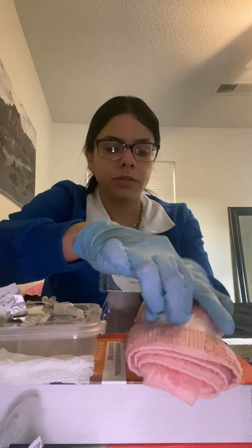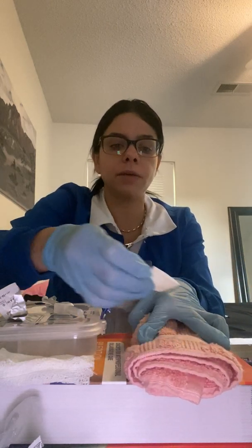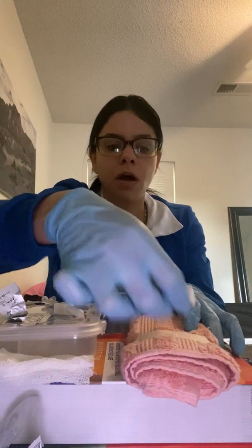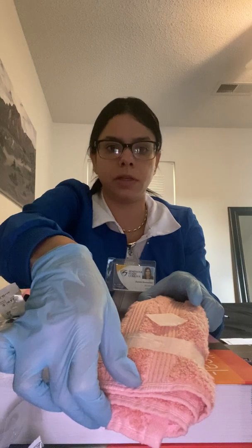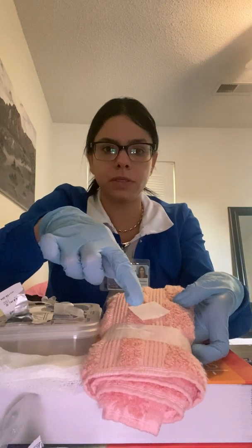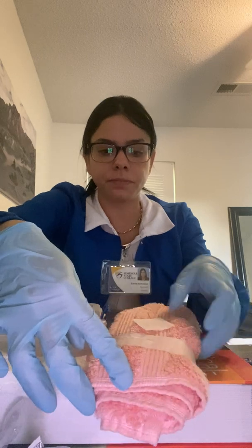All right, so now I have cleaned it. I'm going to let it air dry, and I'm going to use one of the corners of my alcohol pad and put it here or maybe on top. It doesn't really matter, but I want to point to the area that I just cleaned, because it might be easy to forget which area you cleaned. So that is just pointing at the area where I'm going to be injecting.